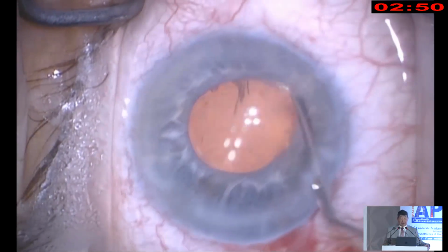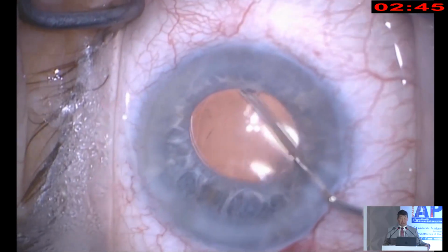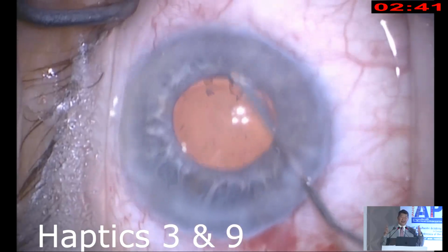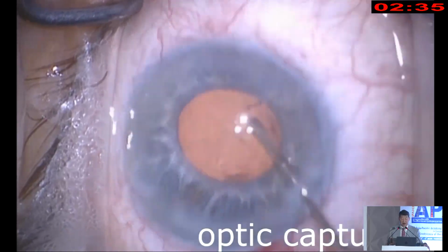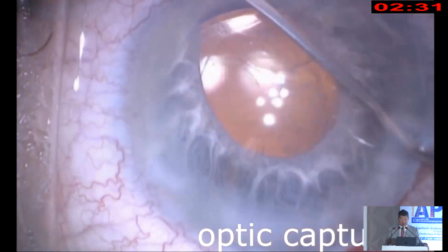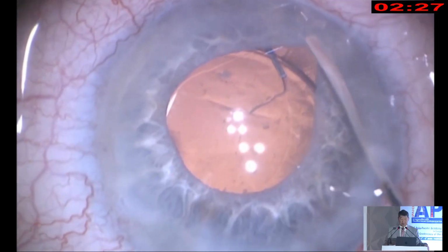But you see that lens is in the sulcus, it's decentered. I think here I'm trying to rotate it. If I can get the haptics to 3 and 9 o'clock, I think that's probably going to help, because a lot of times, you know, when we shake our head and move our eye, that's the orientation of the saccadic movements. And then there's the optic capture, and then I'll retract that there. Okay? All right.